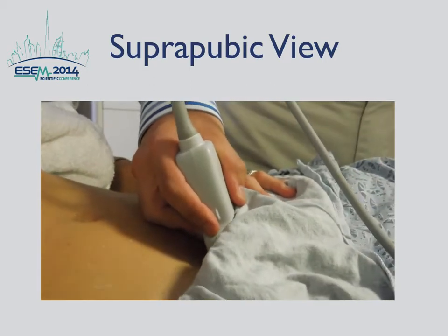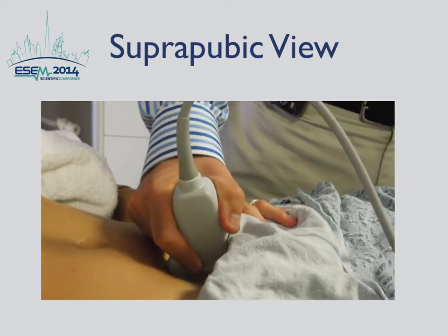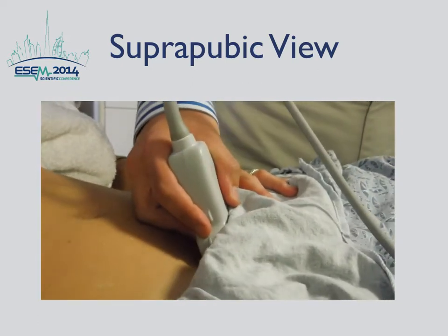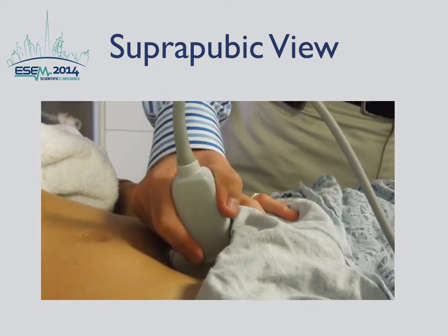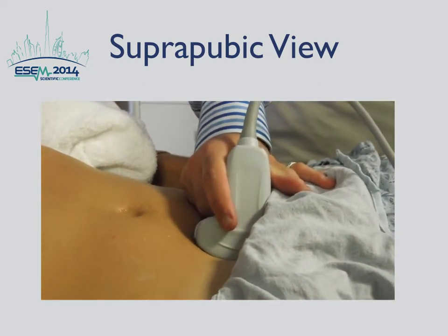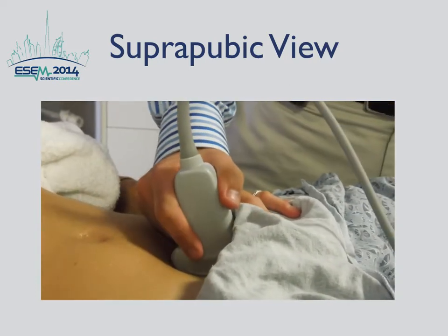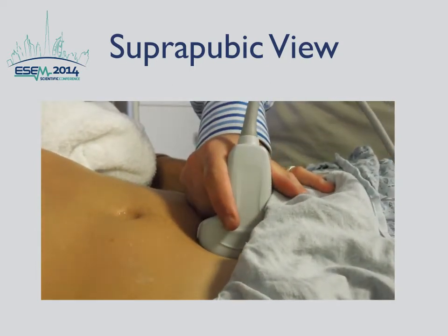Place the probe in the transverse position, probe marker to the patient's right, on the symphysis pubis and angle towards the patient's feet. Remember, the bladder is not always perfectly midline, so sliding to the right and left above the pubis symphysis will bring the bladder into view. The most common reason for difficulty visualizing the bladder is a probe position that is too superior. Remember that the bladder is a pelvic organ and only emerges from above the symphysis pubis as it becomes distended.